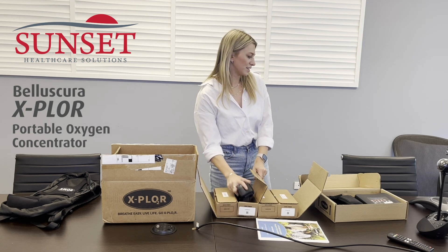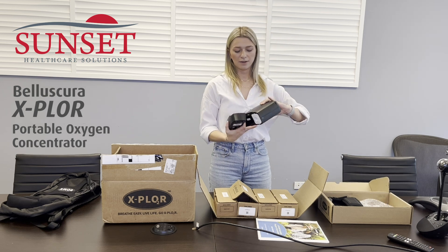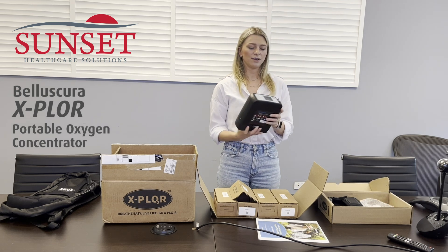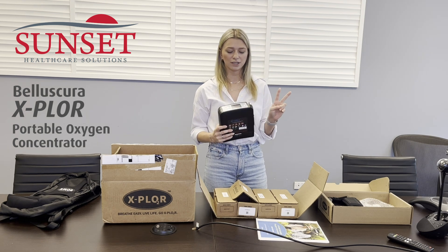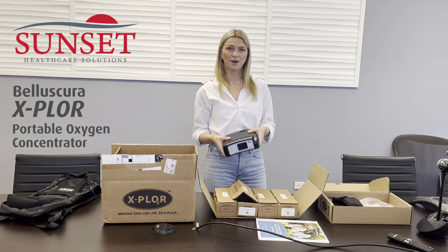So to set up the POC, you would charge the battery and then place it like so until you hear the click. You would press the power button for about three seconds and then it'll turn on at setting two. You can also adjust the settings with the arrows up and down, up to setting four and as low as setting one.